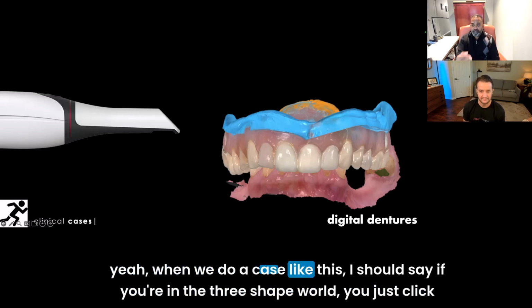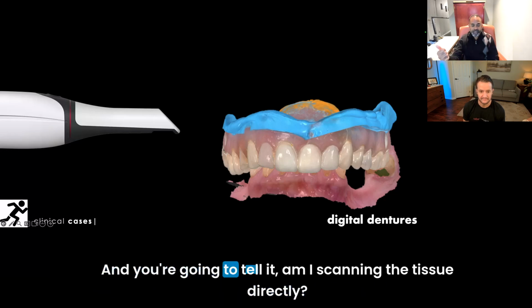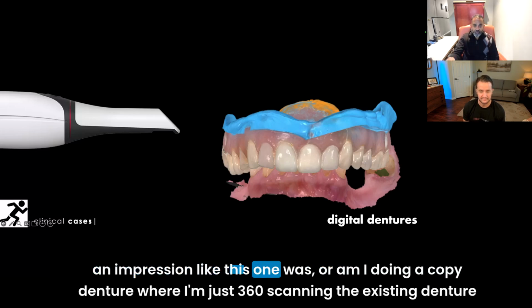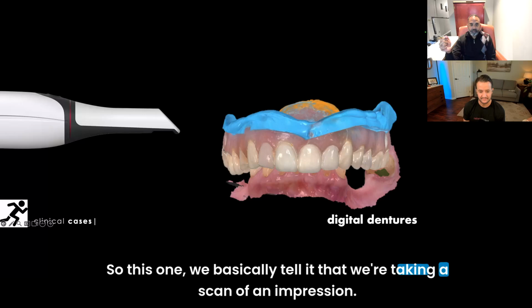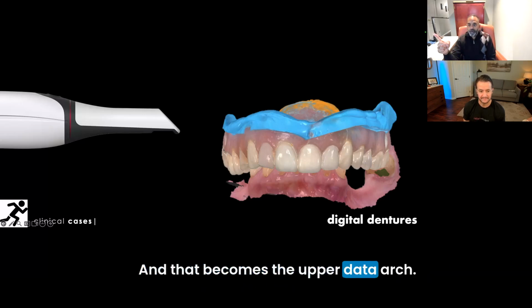Yeah, when we do a case like this, I should say if you're in the 3Shape world, you just click removable on the left side of your Unite software. It'll then open up these different workflows, and you're going to tell it, am I scanning the tissue directly? Am I scanning an impression like this one was? Or am I doing a copy denture where I'm just 360 scanning the existing denture and I'm going to replicate it exactly? Yeah. And so this one, we basically tell it that we're taking a scan of an impression, and that becomes the upper data arch.